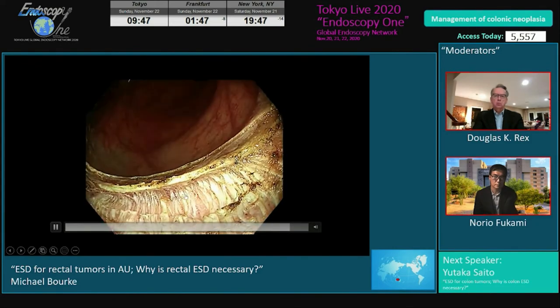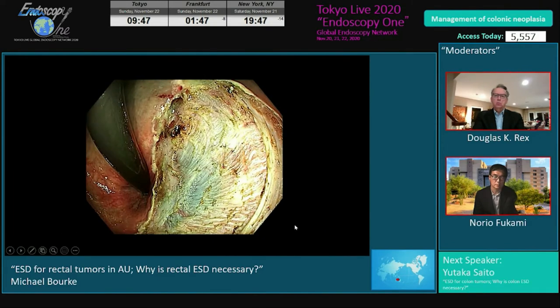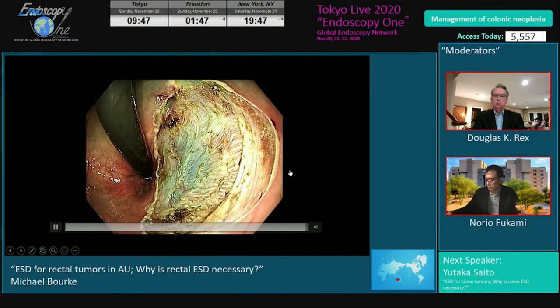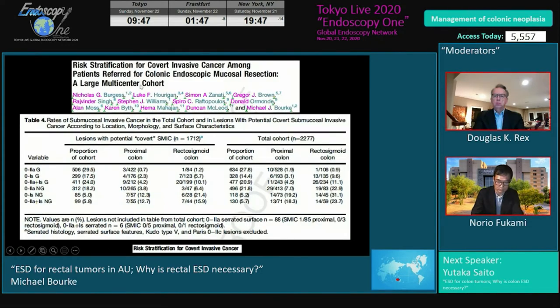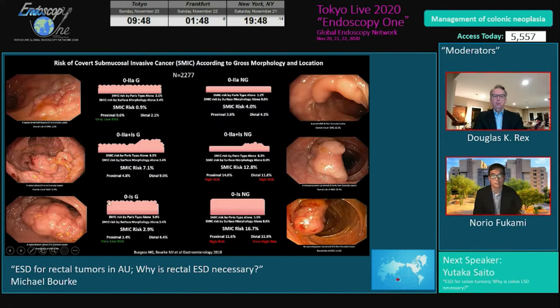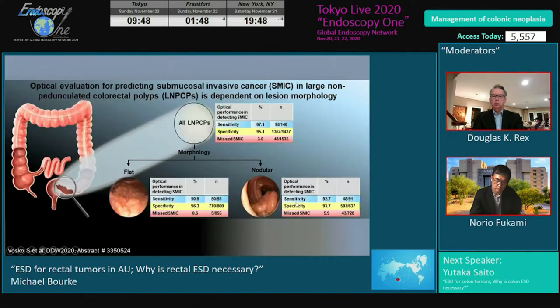Here's the interface between circular and longitudinal muscle layers, then a satellite lesion — small, so we make a big injection and remove it en bloc by EMR with a wide margin of normal tissue. A nice end result. The patient can go home same day or next day with local anesthetic, intravenous antibiotics, and oral antibiotics for five days.